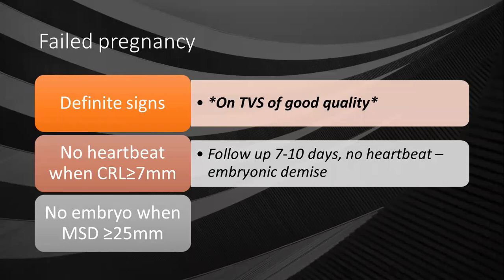I continued to scan, and eventually at some point when I turned on the color Doppler again, there, boom, I see my strong flash of color signal from the embryo. The heartbeat was there. Up to now, I don't know the physiology of what was happening with that baby. So maybe that's why they recommend that we follow up these pregnancies after 7 to 10 days.